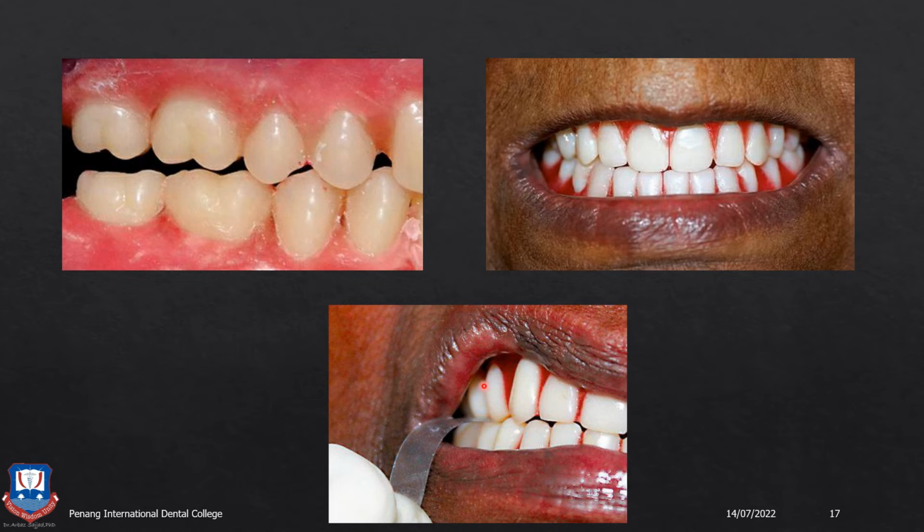Then you also have to check the vertical jaw relationship. That is, the vertical dimension of occlusion is proper on both sides, that is, on the right and left working side. So you place mylar strips or occlusal shim stock or articulating paper between the teeth on premolars and molars on each side, and you pull it to see whether the teeth are in proper contact or not, whether there are occlusal prematurities or whether the teeth are out of occlusion.